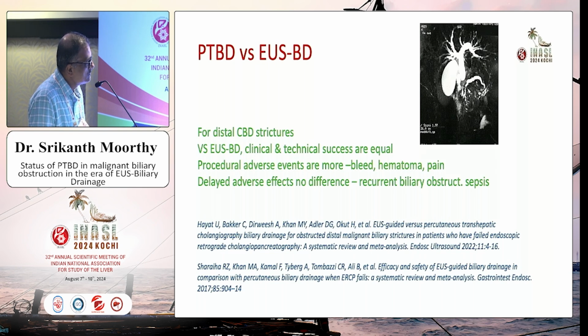And it makes it so easy for EUS to just put a stent from the left system into the stomach. Don't go anywhere near the stricture. And so that's exactly what we have. When you actually look at this data, it shows that for distal biliary strictures, PTBD versus endoscopic ultrasound, technical and clinical success rates are equal.